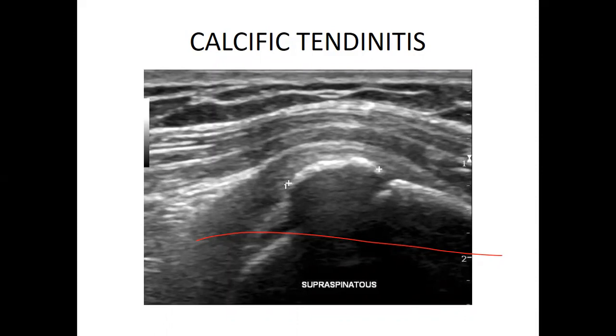For example, the mechanism of the subscapularis tendon. One of its roles is to stabilize the shoulder joint. So I'll quickly go into the subscapularis tendon and look at it. Is it okay? Is it fine? And I'll do mostly the dynamic assessment, because where you have dislocation, you expect some loose joint connection within the soft tissue.